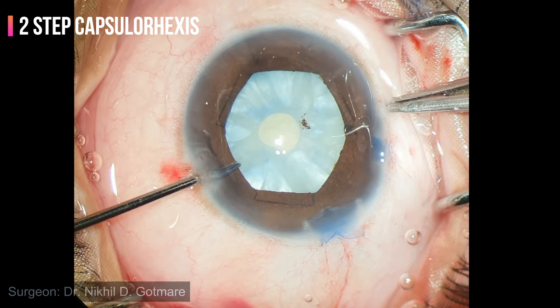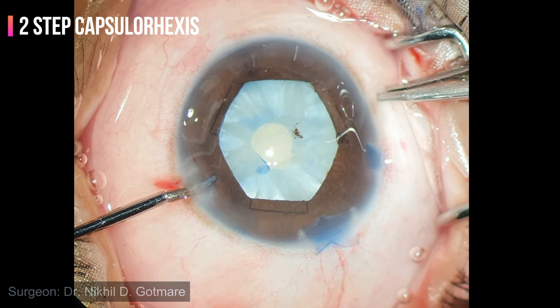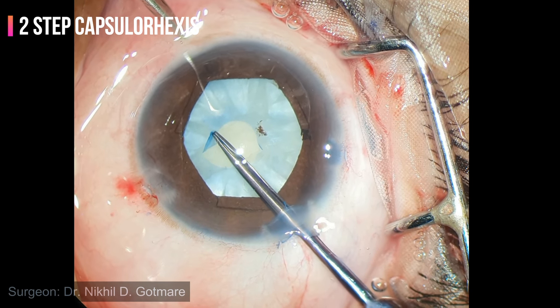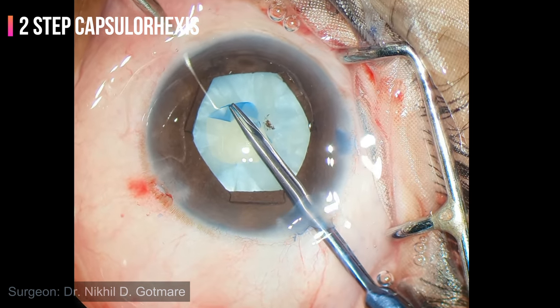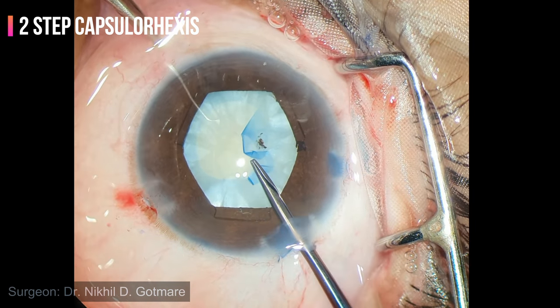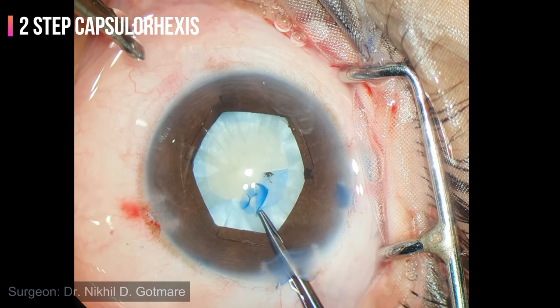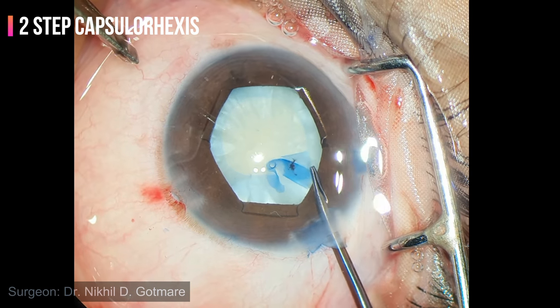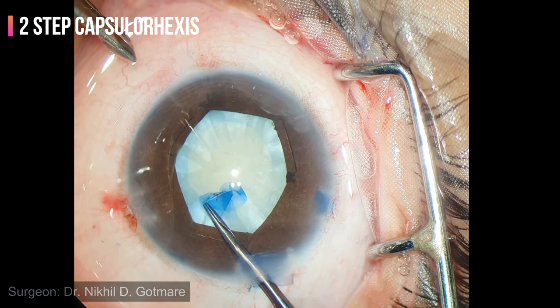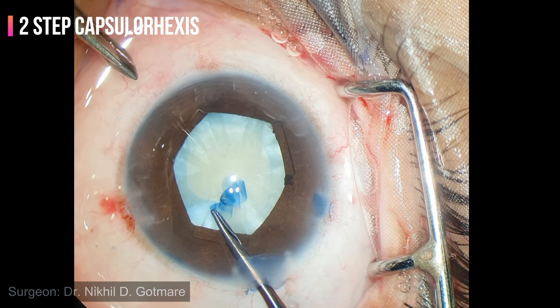Once the bag is sufficiently decompressed, a cut is given on the smaller rhexis using micro-scissors, and then using capsulorrhexis forceps, a larger rhexis is made. A cross-action CRF is preferred as it causes lesser viscoelastic loss. If the capsulorhexis is too small, it may result in post-operative capsulophimosis, so the aim is to achieve a capsulorhexis of around 5.5 mm. This will also prevent formation of posterior synechiae between the iris and anterior capsule post-operatively.